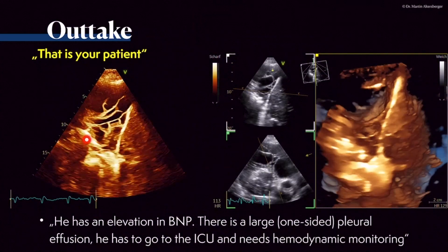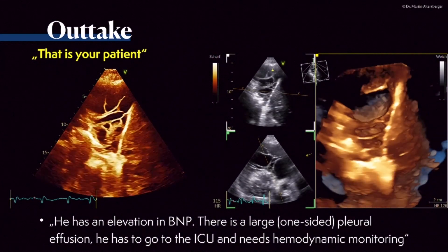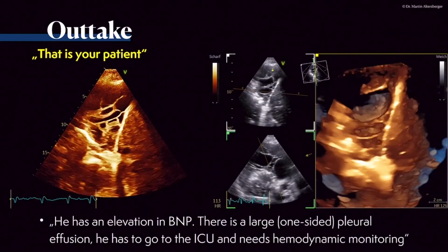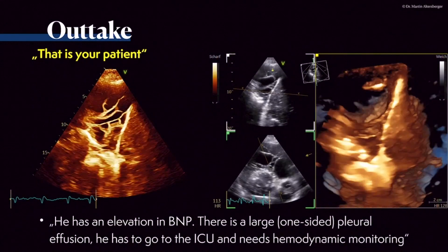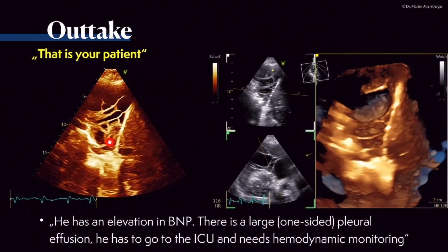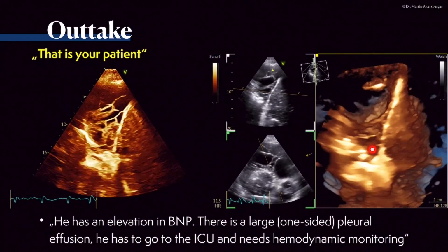Here you see a complicated pleural effusion with a lot of strands inside. So this was a patient where the suspicion was that this is either cancerous or severe infection, for example, empyema. Overall, this patient was respiratory stable, and it turned out to be a carcinosis of the lung and also the diaphragm. Here you see a consolidation, a complicated pleural effusion.